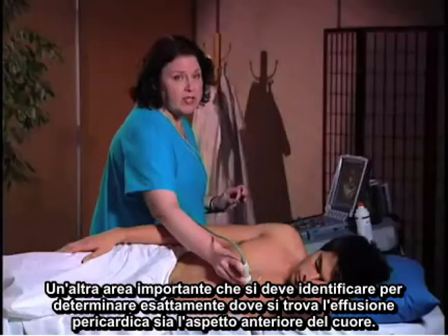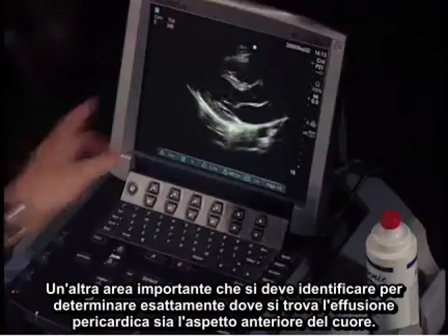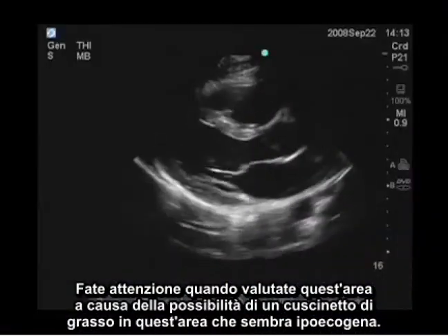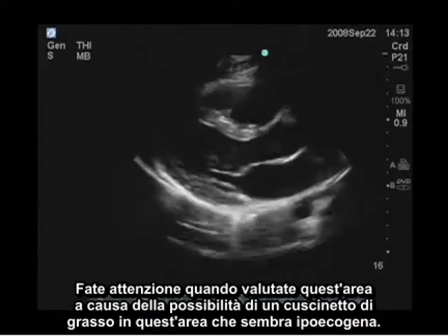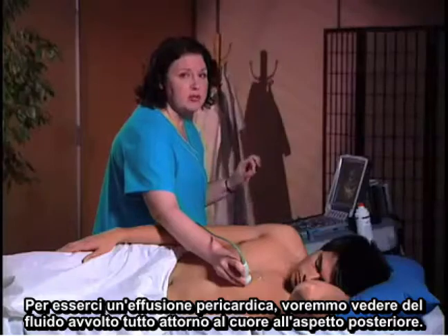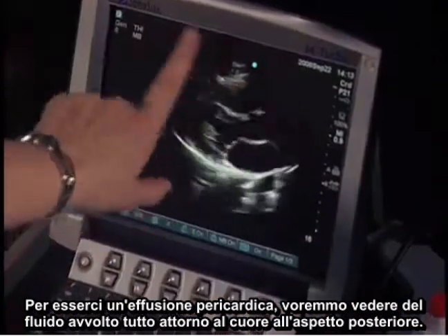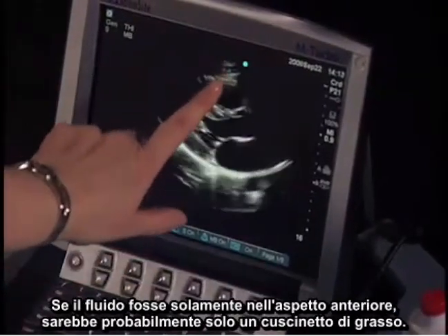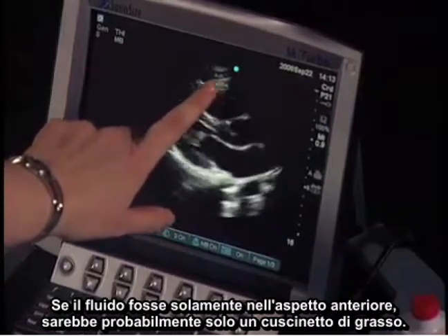Another important area you have to identify is the anterior aspect of the heart. You have to be careful when evaluating this area because there could be a fat pad that appears hypoechoic. For it to be a true pericardial effusion, we want to see the fluid wrapping all the way around the heart to the posterior aspect. If it's only in the anterior aspect, it's probably just a fat pad.